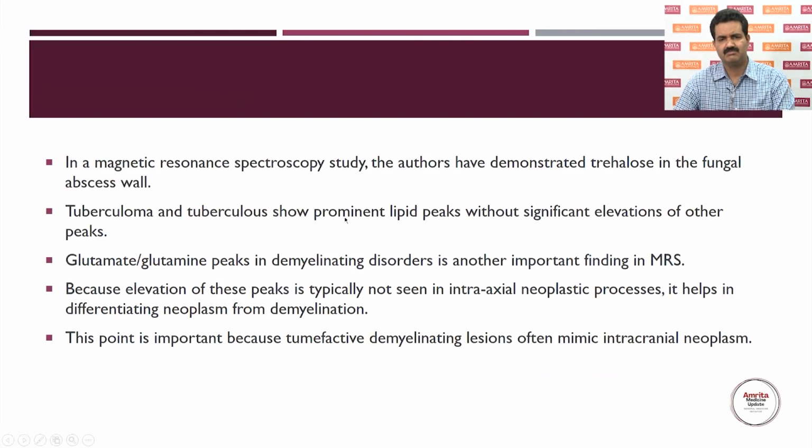So tuberculoma shows a lipid peak. That's a very important point. And in demyelinating disorders, we can see glutamate or glutamine peaks. So all these peaks in the spectroscopy may give us a clue.